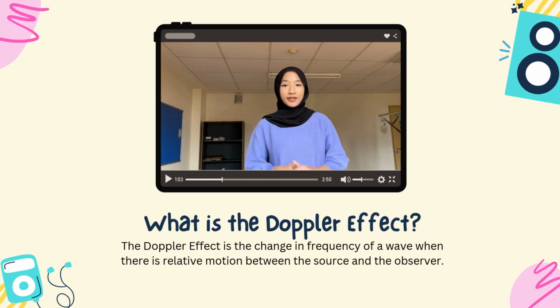The Doppler effect refers to the change in frequency of a wave when there is a motion between the source and the observer. When the source moves closer, the frequency increases, and when it moves away, the frequency decreases.